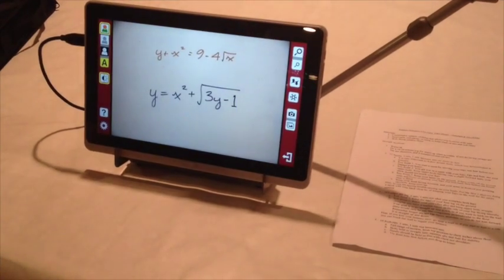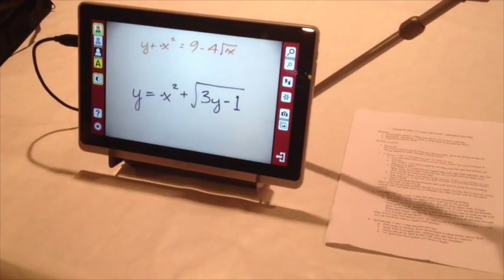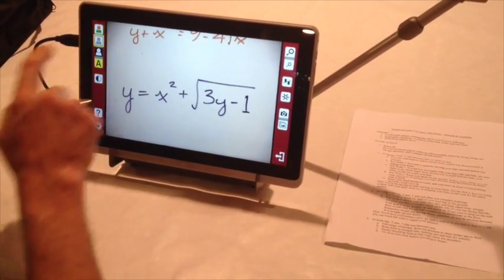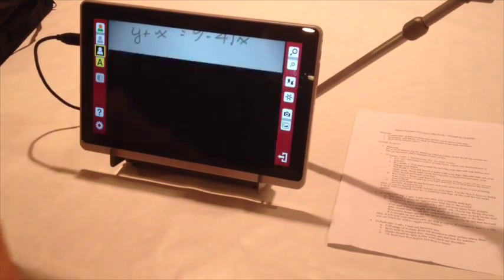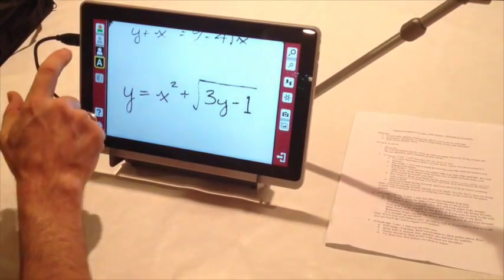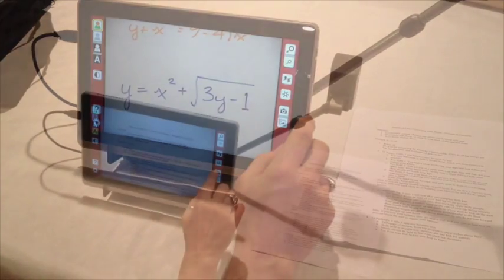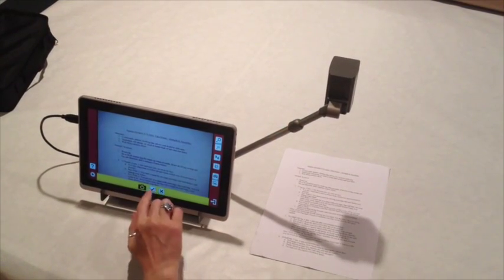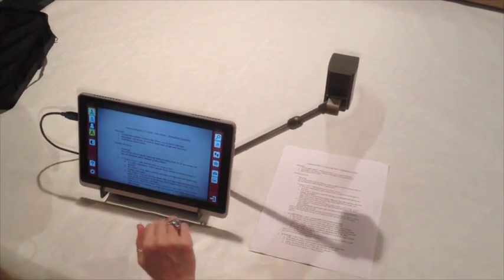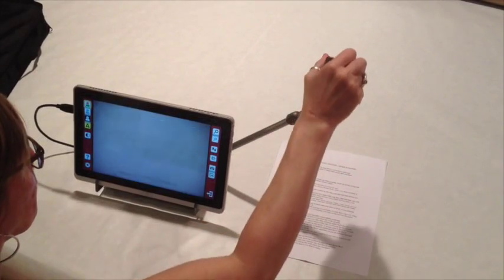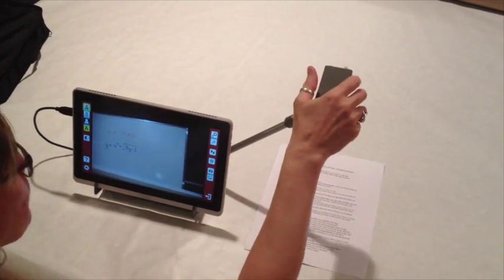All the user controls appear as icons to the left and right of the video screen, including color and black and white imaging, as well as various binary modes for reading. You can freeze the image, flip the image, zoom in and out, even take snapshots and save them to the hard drive for later use.